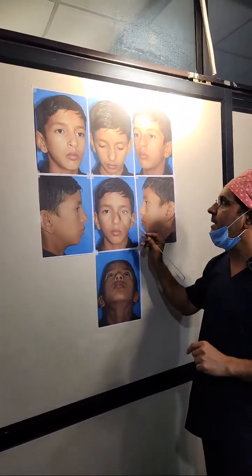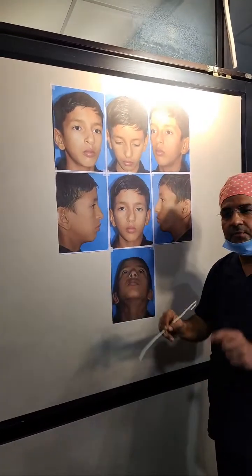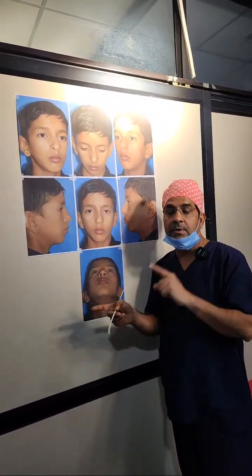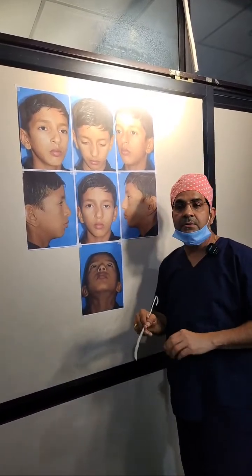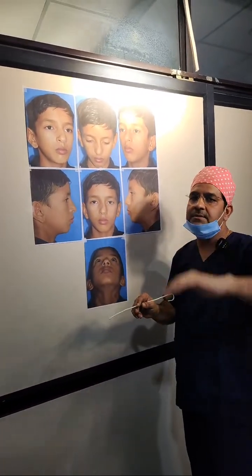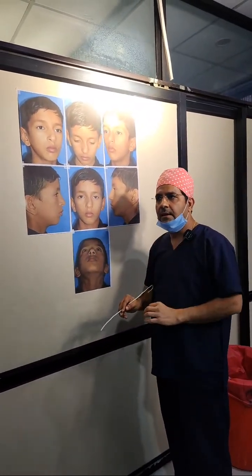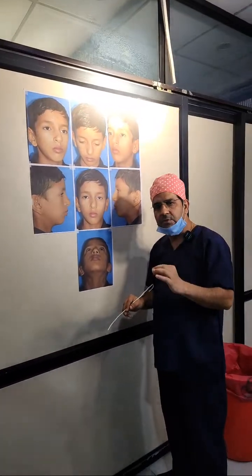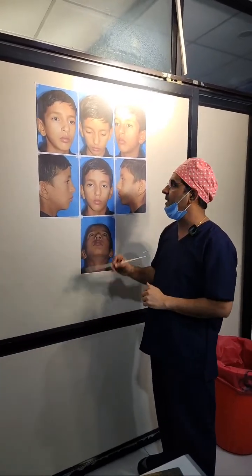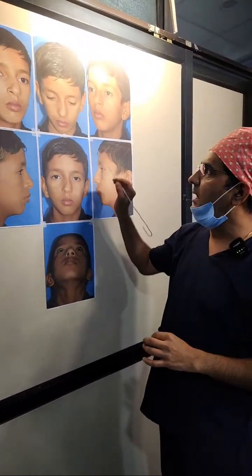And maybe this patient needs an intermediate osteotomy on the left side, so first you use the intermediate osteotomy rather than the paramedian and lateral osteotomy, because if we use the lateral osteotomy first, then it's very difficult to do the intermediate osteotomy in a destabilized bony segment. So these are the two important things: the sequence of the osteotomy, which osteotomy you use first, and the side also, either the concave side or the convex side. So the key in the correction of this patient is septum modification and then osteotomy.